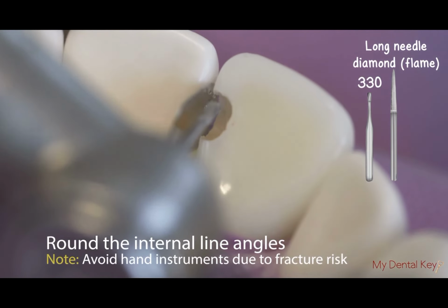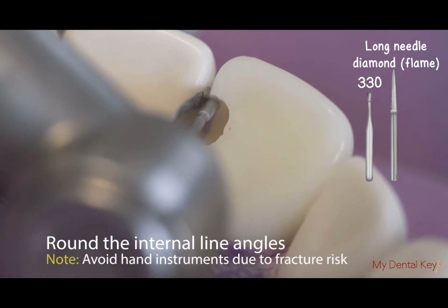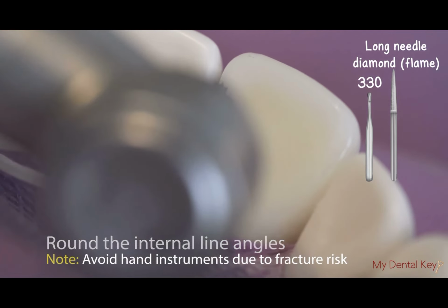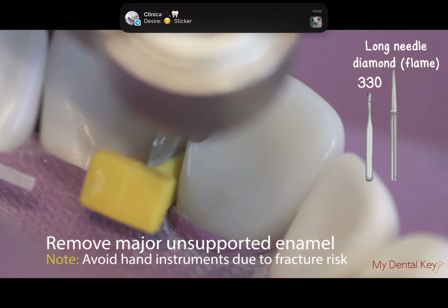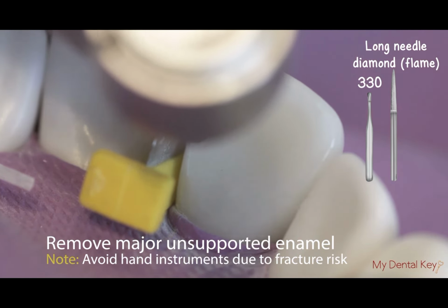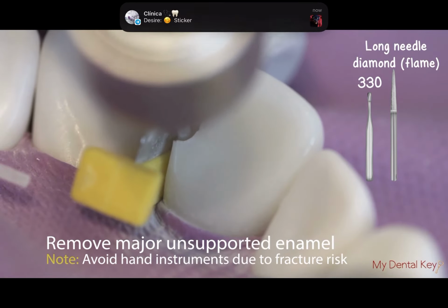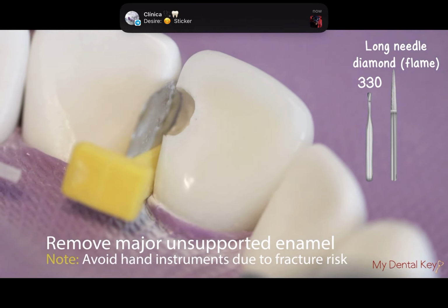Next, ensure that the internal line angles of the preparation are rounded. Use your rotary instruments and 330 burr to do so. Now smooth the preparation with rotary instruments, as using hand cutting instruments may cause chipping or fracture to the tooth. Continue to smooth and remove ledges from the preparation. You can use the 330 carbide burr here.